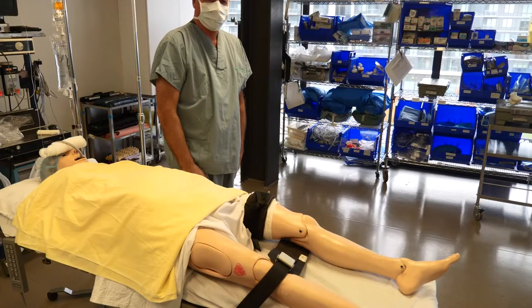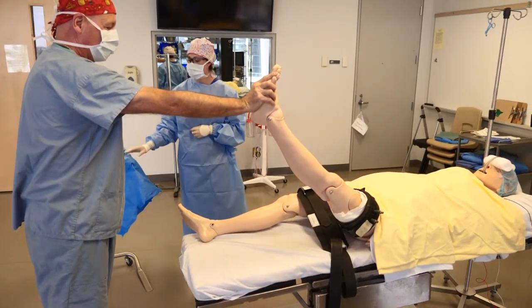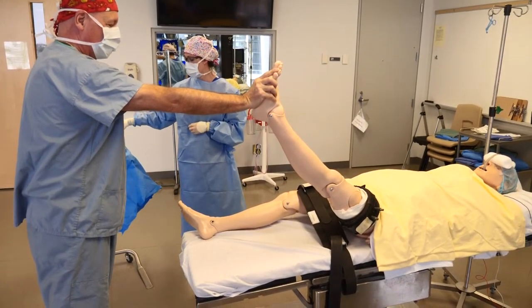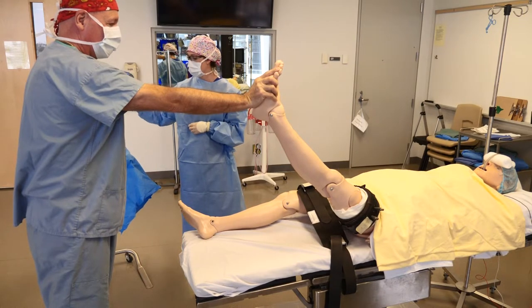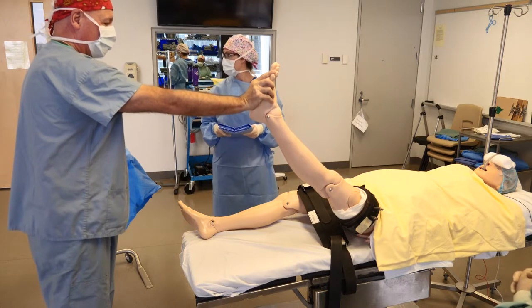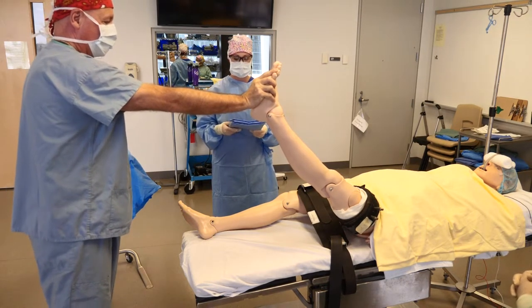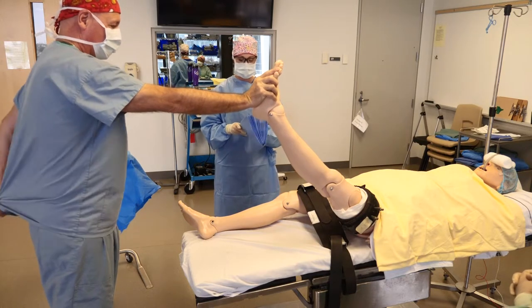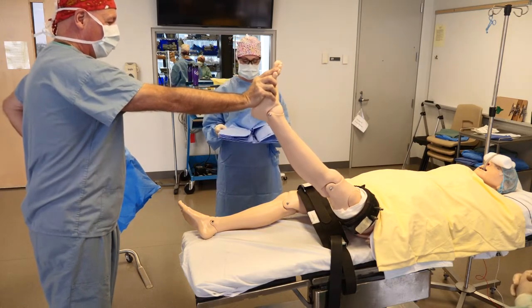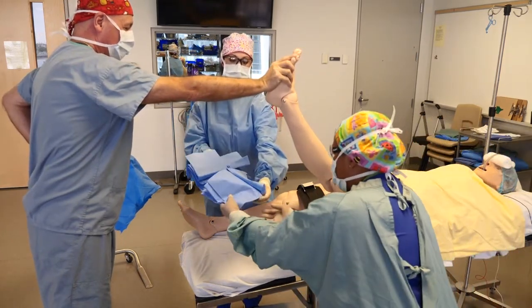After this, they will actually prep the knee for surgery. The patient's left leg has just been prepped and they've waited the appropriate amount of time for it to dry. The circulating nurse is lifting up the leg, and we have one of our residents who is going to use what's called an approach sheet to establish a sterile surface to work with.